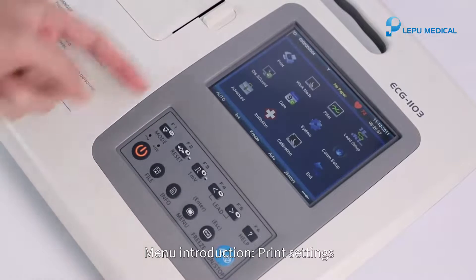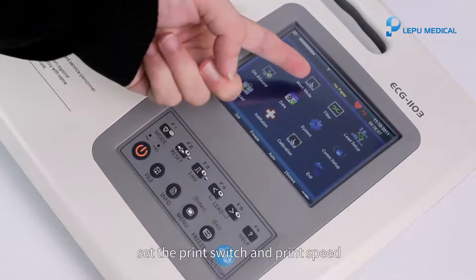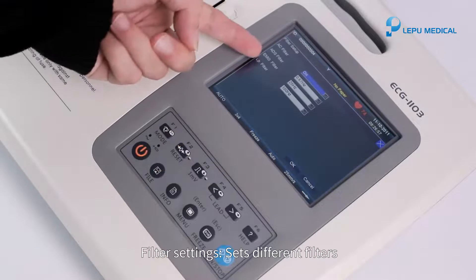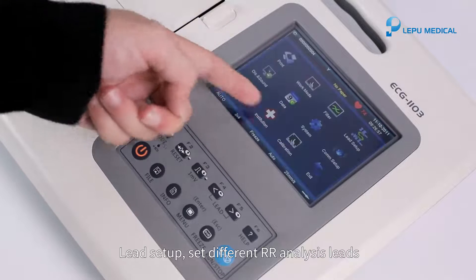Menu introduction. Print settings: set the print switch and print speed. Work mode: select the demonstration mode. Filter settings: sets different filters. Lead setup: set different RR analysis leads.